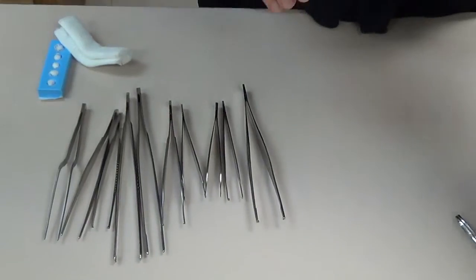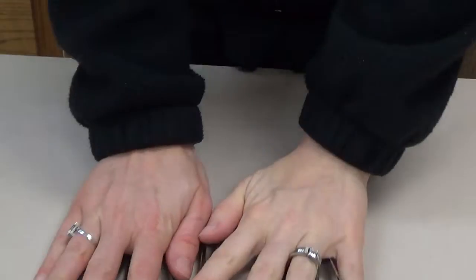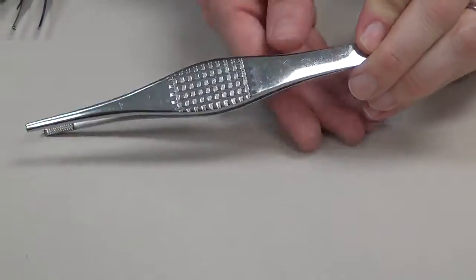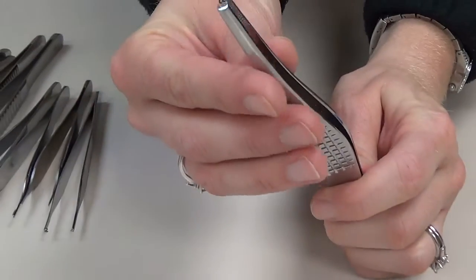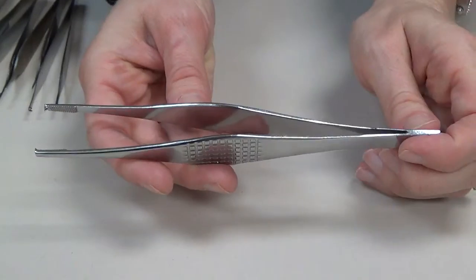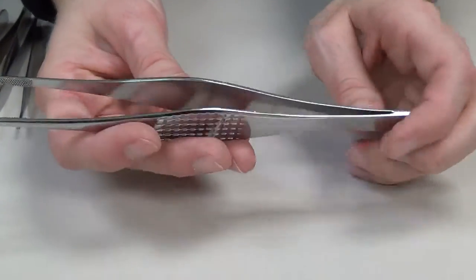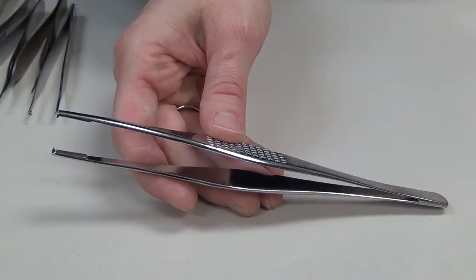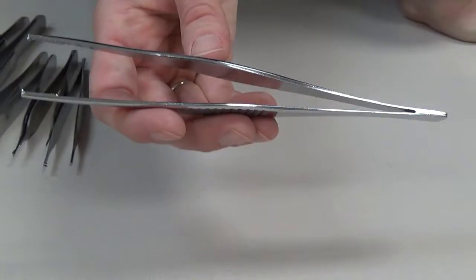Our non-clamp grasping items are referred to as forceps, and there are various types utilized with different tissue. The largest is what we refer to as the Ferris Smith. It's a very large forcep with very thick teeth at the tip, so it's going to be utilized with thick, heavy tissue such as muscle fascia, tendons, and joint capsules. It's very commonly utilized in orthopedics but can also be used when closing muscle fascia on an abdominal case.